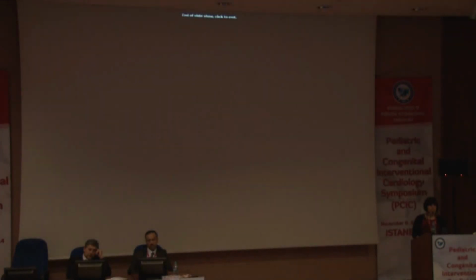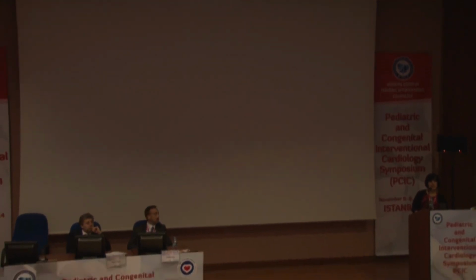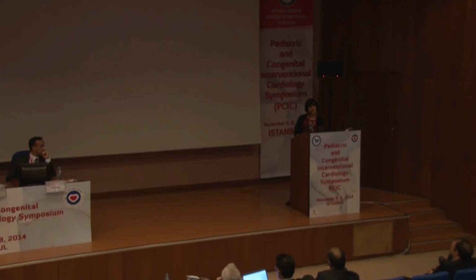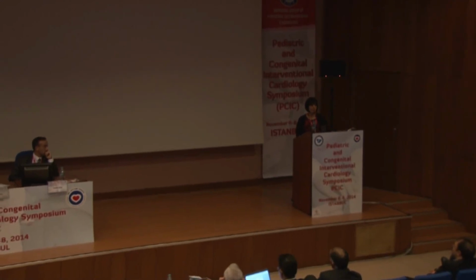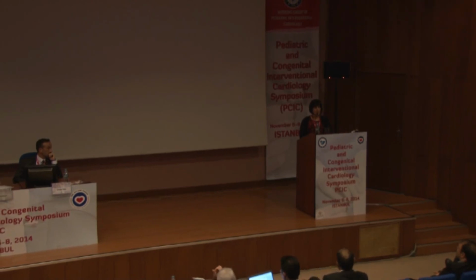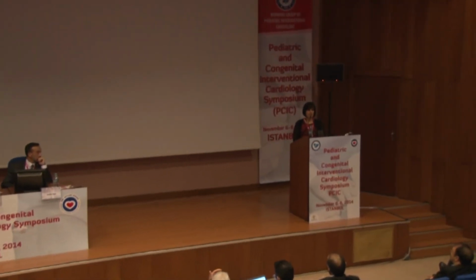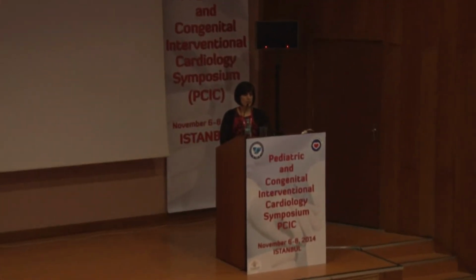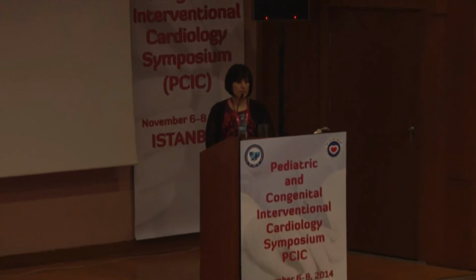Obviously, this was not the final treatment. After a few weeks, the stent had to be redilated, but this time in the cath lab, and a coarctectomy could be done a few months later. Usually, if we do these bailout stenting, we don't wait too long, because our surgeon says that if the weight is okay, it's better to take out the stent around about 3 to 4 months, because it's easier to take out and the surgery is quite straightforward.